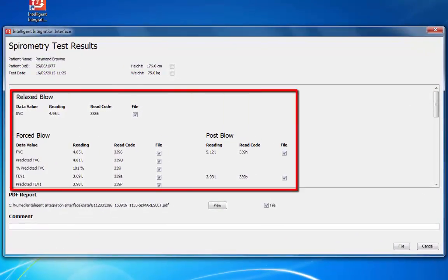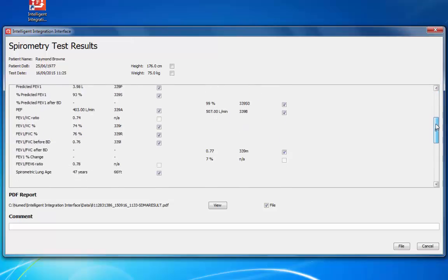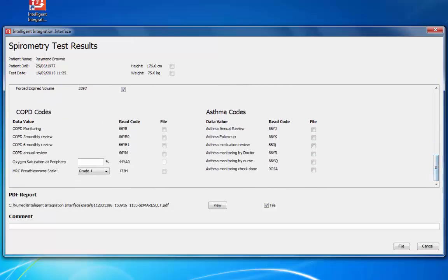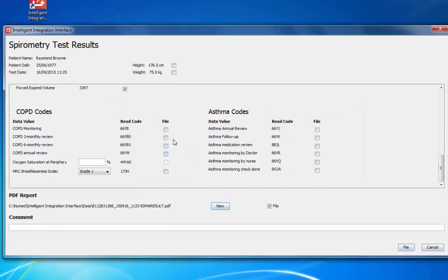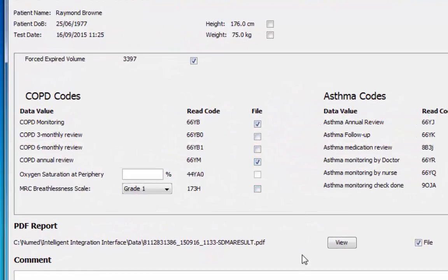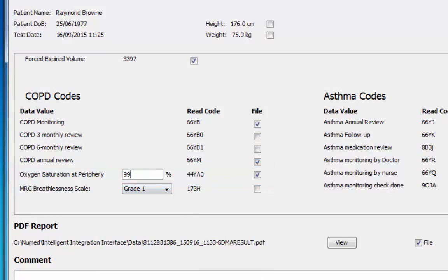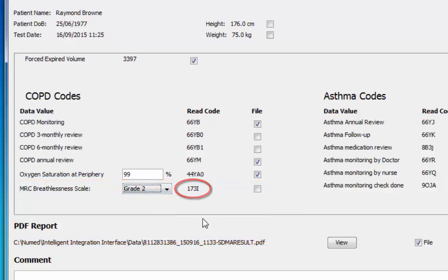Any items with data values available will automatically be selected for filing. Items can be deselected to prevent the data value from filing. Scroll down to see all the values and supplementary codes available. Also available are options to file read-coded entries relating to COPD and asthma monitoring. An oxygen saturation reading taken from an external device can be entered and filed as a read-coded value alongside the spirometry data. The MRC breathlessness scale can be selected from the drop-down box and the read code will automatically be adjusted to reflect the grade selected.